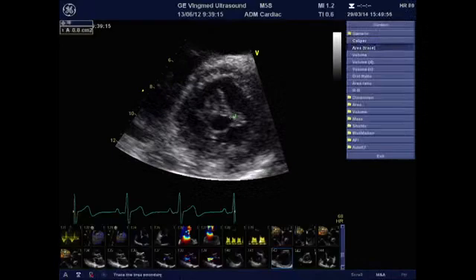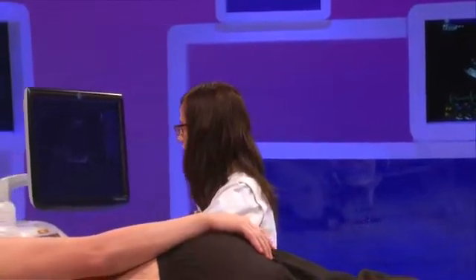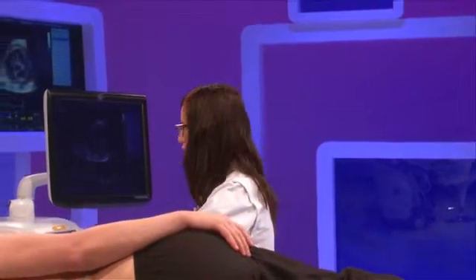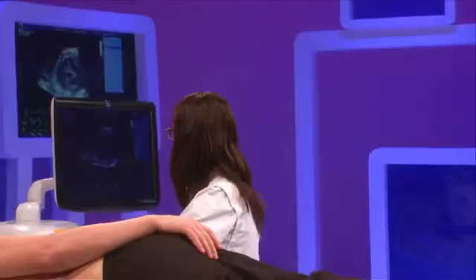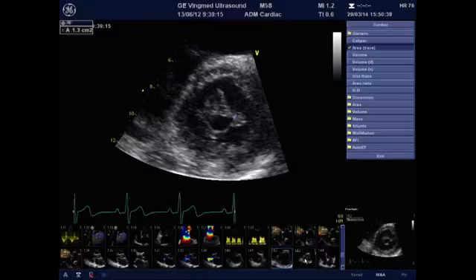You'll start from the commissure and go to the black and white interface, going clearly around the leaflet borders up to the first commissure, and you see here that I have a mitral valve area measured in 2D planimetry of 1.3 centimeters square, which suggests a significant mitral valve stenosis. Just as a reminder, a hemodynamically significant mitral valve stenosis is defined as a mitral valve area of less than 1.5 centimeters square, while a severe mitral stenosis is defined as a mitral valve area less than 1 centimeter square.